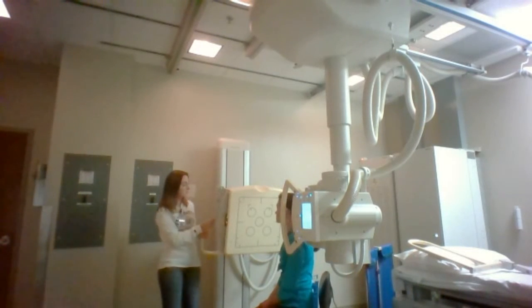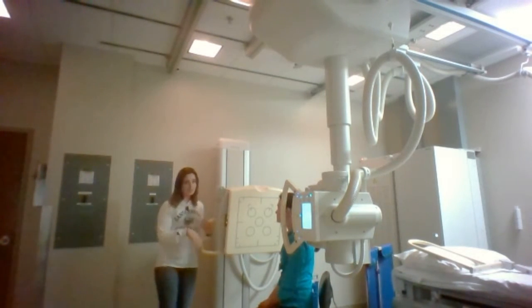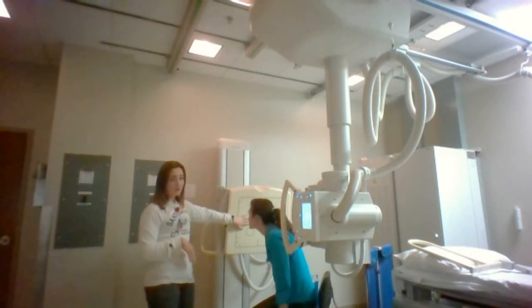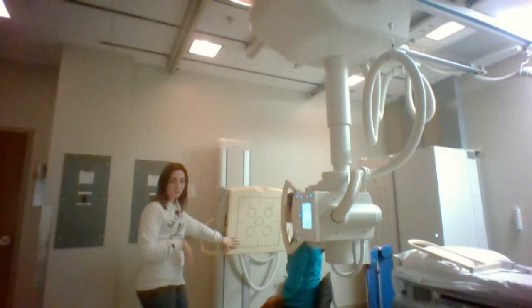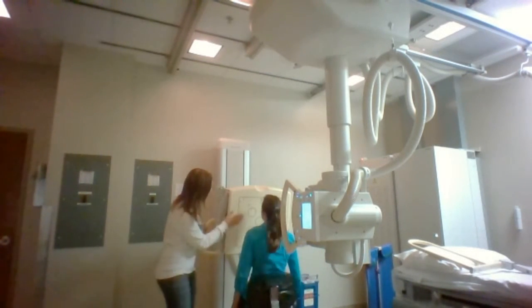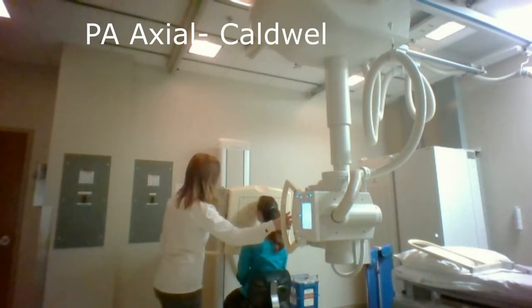There we go. And then I'm going to be having my patient face the board, and I'm going to be having her match the angle of the board with her face. So Sky, go ahead and scoot on nice and close in, and I want your forehead and nose to be touching.